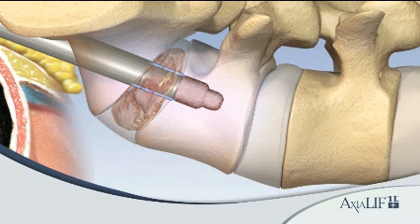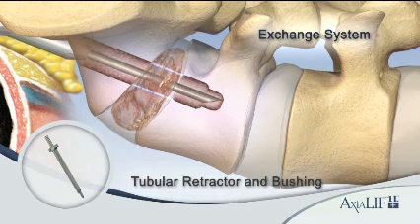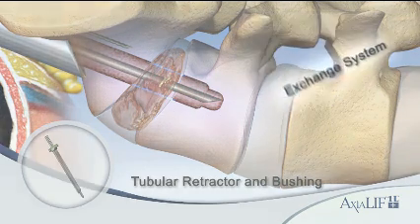Remove the 12 millimeter sheath with the 10 millimeter dilator. Insert sequentially the exchange bushing and tubular retractor over the guide wire. While holding the tubular retractor on the face of the sacrum, insert two fixation wires to hold the tubular retractor in place.